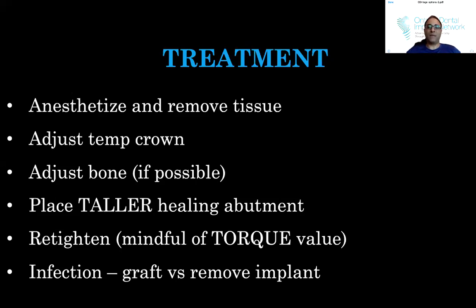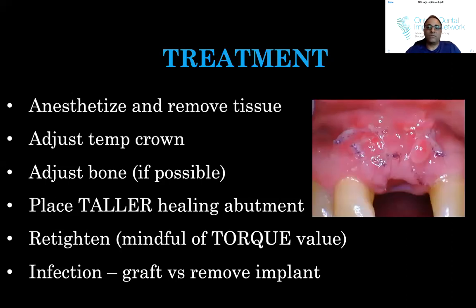Okay, that stuff, now the implant, the graft gets exposed. So you might have to remove the implant. So this is a classic case of a 1-1. It's my good friend Randy. He doesn't listen to anything that I say at all. I should not have done an immediate anterior for him, to be honest with you. But I did anyways. He got headbutted twice. Once by his wife and once by his buddy, apparently. So his temporary crown came off 4 times, even though it was completely out of occlusion.